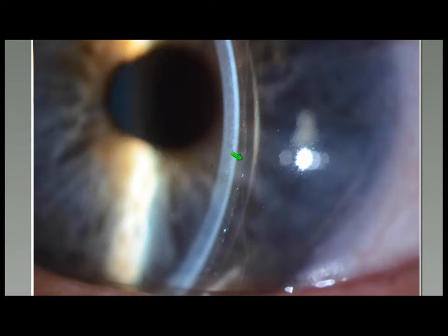Now, when I'm actually showing you the images of what I'm looking at with the patient, we're going to flash these up. And what I want you to pay particular attention to is this space right back here. Now, it'll take some practice to be able to judge the vault, but you can compare the thickness of the reservoir to the known thickness of the scleral lens or the approximate thickness of the cornea.